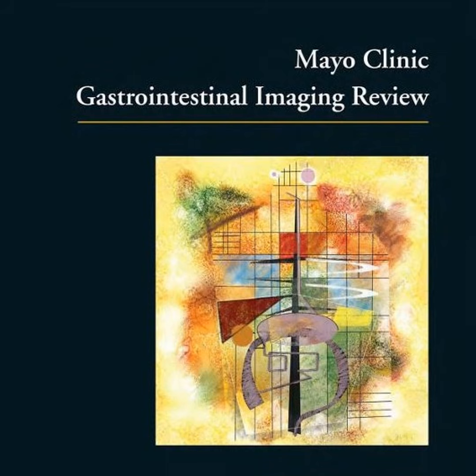Right, they're fluid-filled. So when you run a T2-weighted MRI sequence, which naturally highlights fluid, these complexes become markedly hyperintense. They just shine brightly. And then you administer gadolinium contrast to evaluate the vascular kinetics. A metastatic tumor typically shows robust enhancement due to tumor angiogenesis. Right. It drinks up the contrast. But a biliary hamartoma, being predominantly fluid and dense fibrous stroma, shows no internal enhancement whatsoever. You might see a microscopic rim of enhancement, but that's just the compressed normal liver parenchyma reacting to the contrast. Exactly. It's not a tumor capillary bed. The MRI physics confirm the benign pathology.